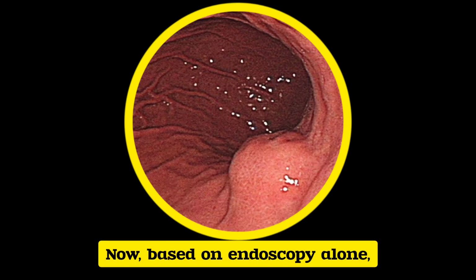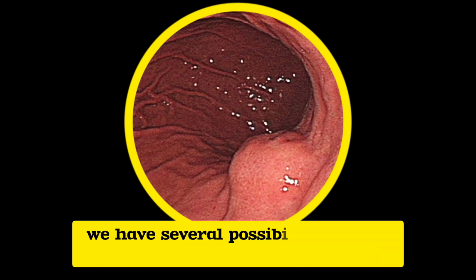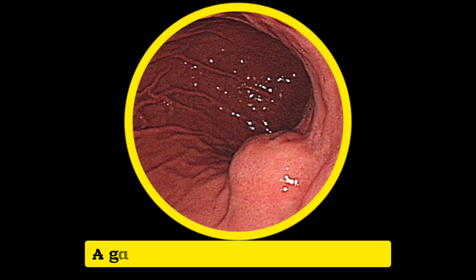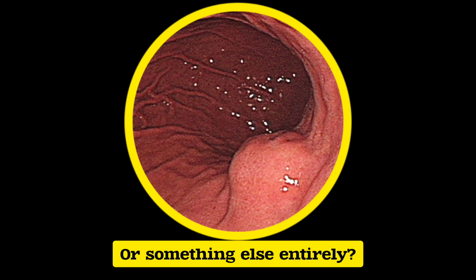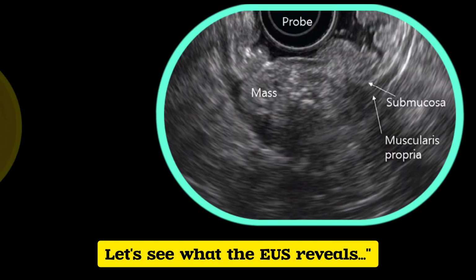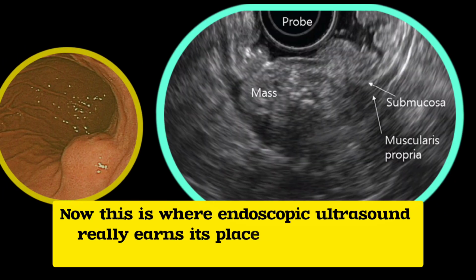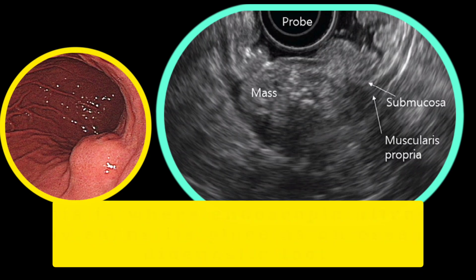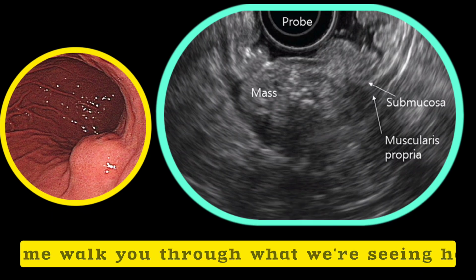Now, based on endoscopy alone, we have several possibilities in our differential. Could this be a lipoma, a gastrointestinal stromal tumor, a leiomyoma, or something else entirely? Let's see what the EUS reveals. Now, this is where endoscopic ultrasound really earns its place as an essential diagnostic tool. Let me walk you through what we're seeing here.